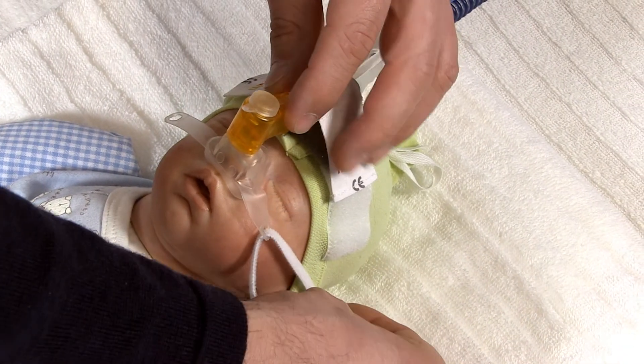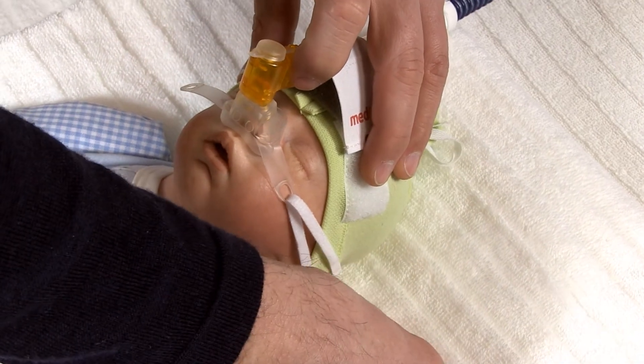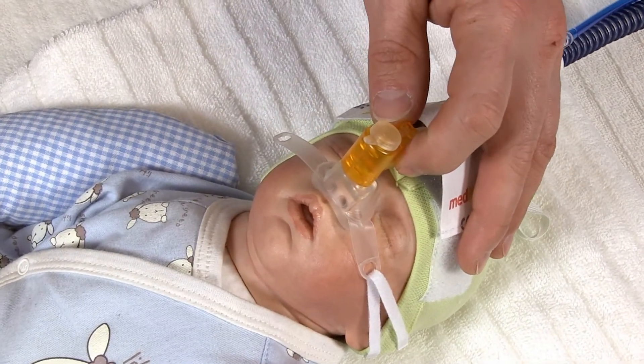Use the fixation straps to hold the mask or prongs in place and to reduce leakage. Mount them in a V-shape on either side of the bonnet.